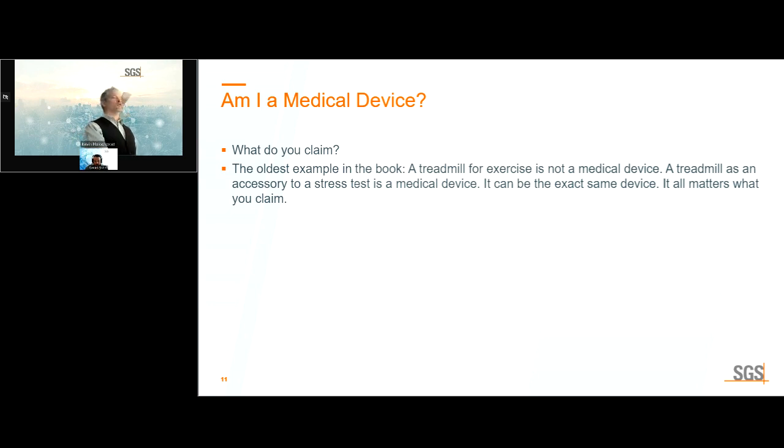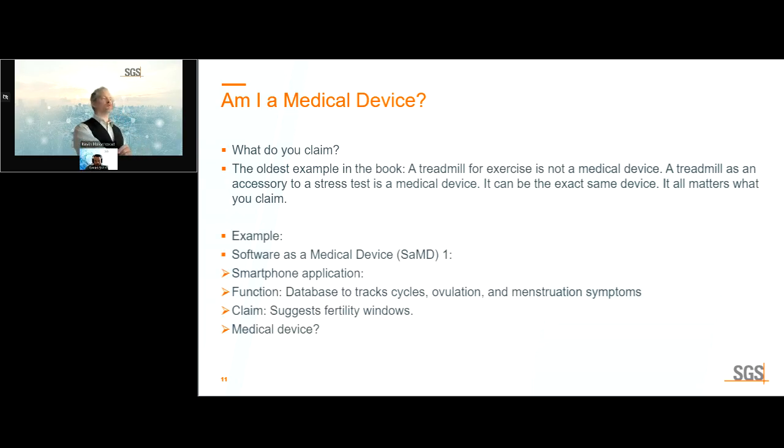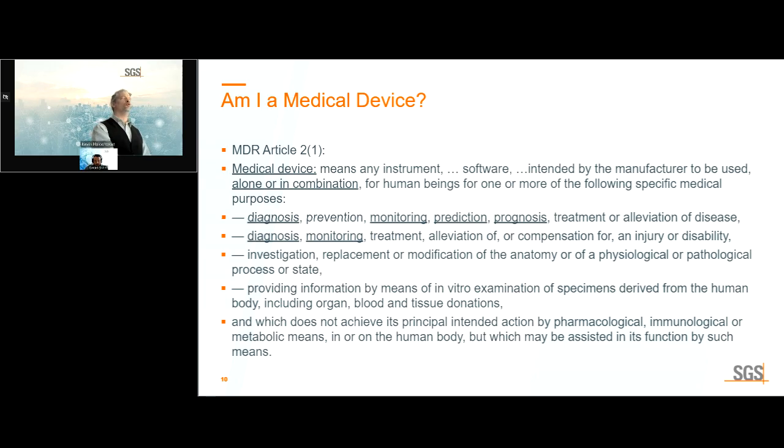Now, let's actually take a step back for a moment. Before we start stepping into our examples, a lot of people will use the word diagnosis or monitoring slightly incorrectly. So I will point everybody at MDCG 2021-24. There are definitions on page 43 and on page 12 for the meaning of diagnosis and the meaning of monitoring and measurement.